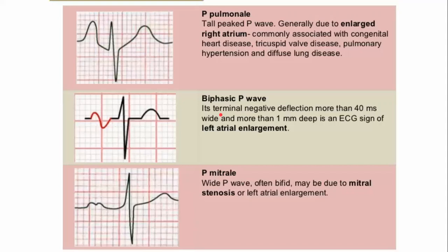And remember, when you have left atrial enlargement, bigger and bigger and bigger, what's that associated with? That's associated with refractory atrial fibrillation. So you have to be careful about that when you're looking for that left atrial enlargement for whatever reason. And remember, we were saying atrial fibrillation has all these things that kind of lead up to it. Well, this is one of them. Left atrial enlargement for whatever reason.